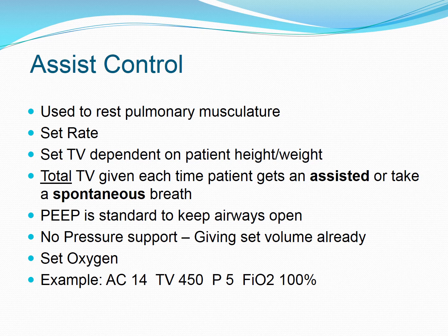With assist control, there's no pressure support because the patient is always getting positive pressure with the assist control mode. Down at the bottom, you'll see that the PEEP is 5, and that's normal physiological PEEP. And then the FiO2, which is the oxygen, is set at 100%.